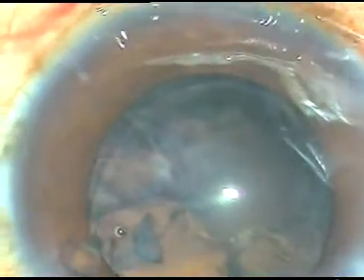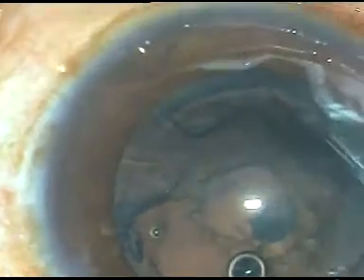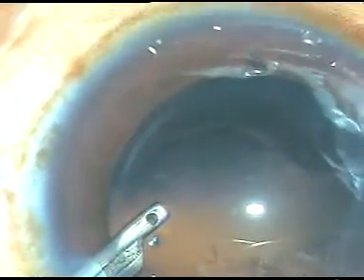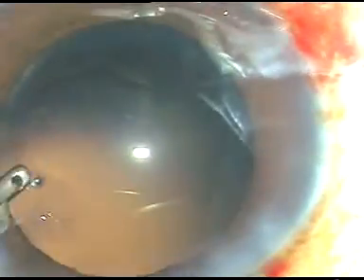Think if I tried the divide and conquer technique in this soft cataract — how long I would have to try and how long I would work with ultrasonic energy inside the anterior chamber. The sooner we learn this lens tilt technique, the better we can protect the corneal endothelium. And it is a very safe technique. One equator of the cataractous lens supports the posterior capsule while you emulsify the other equator.